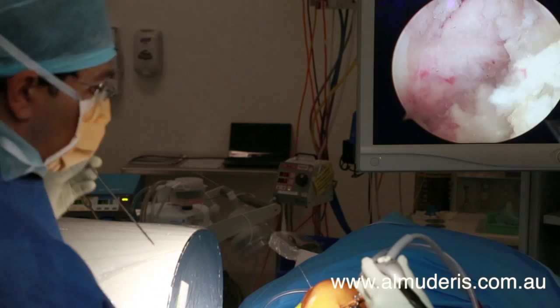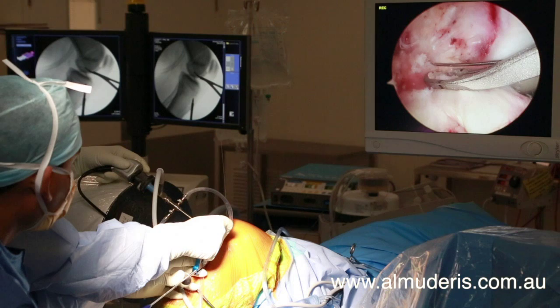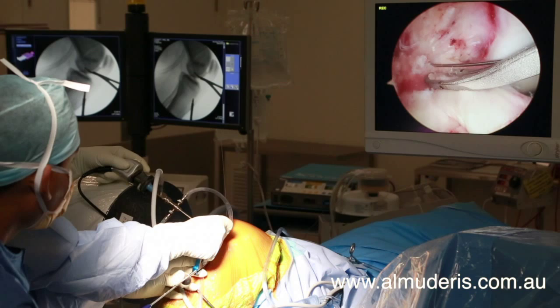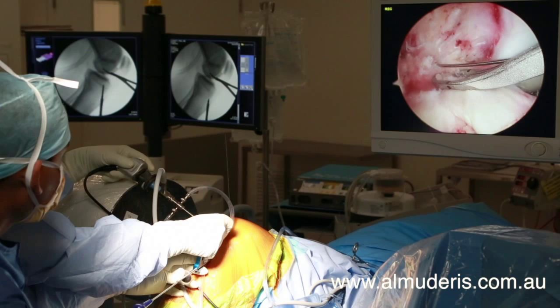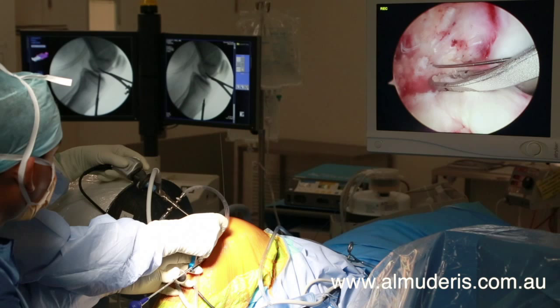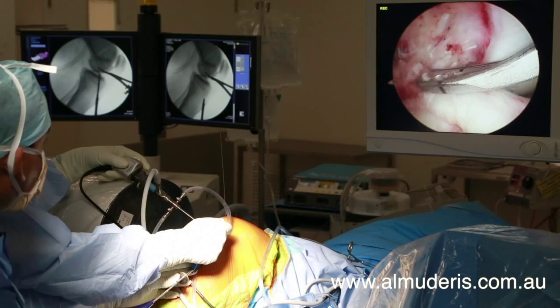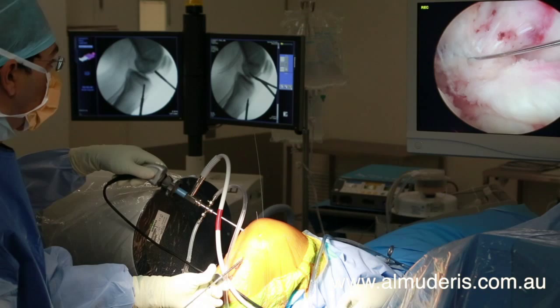A nitinol wire is passed into the tunnel created. Similarly, on the tibial side, a second tunnel is drilled into the joint space. Once vision can be confirmed, drill guides are removed.